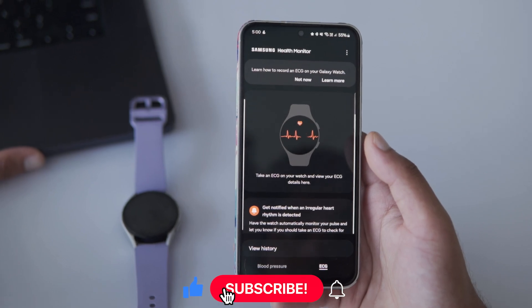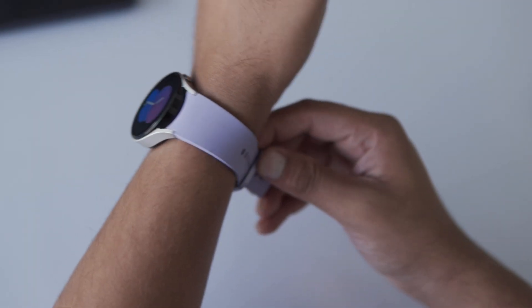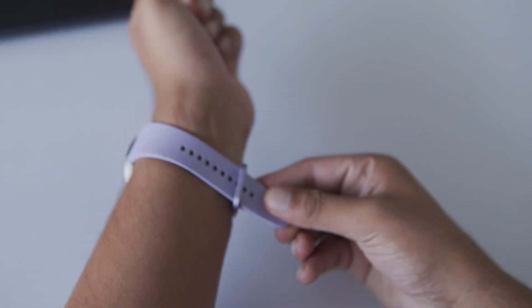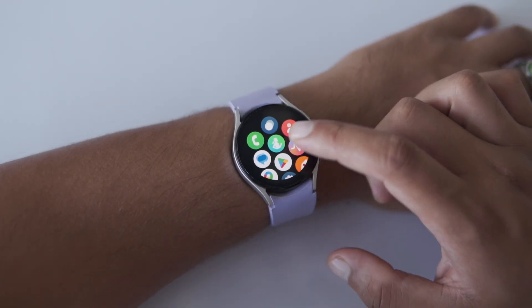Just tap Done and you're good to go. Now let's get into how you can easily measure your ECG using the Galaxy Watch. Step 1: make sure the watch is snug on your wrist — not too tight, but not too loose either. Then open the Samsung Health Monitor app on your watch.